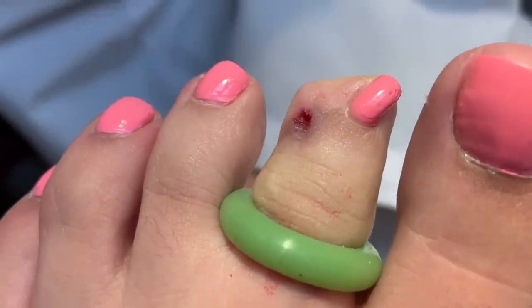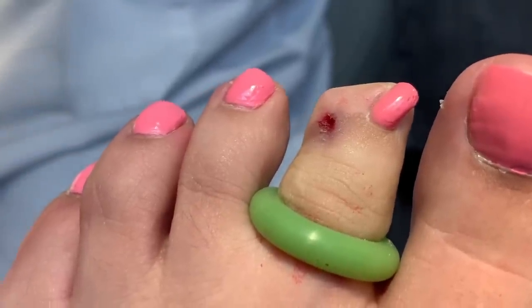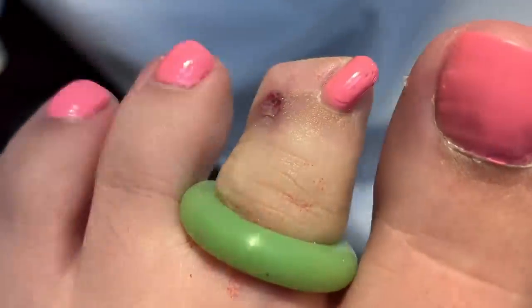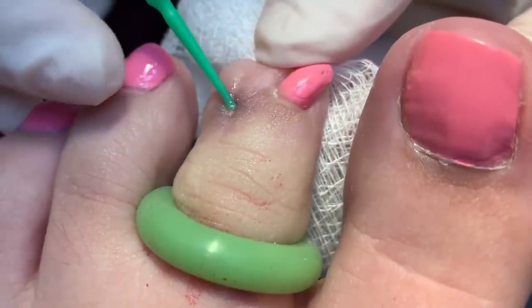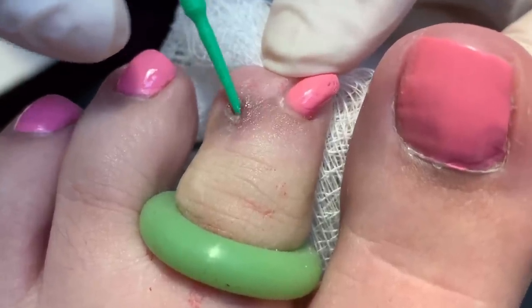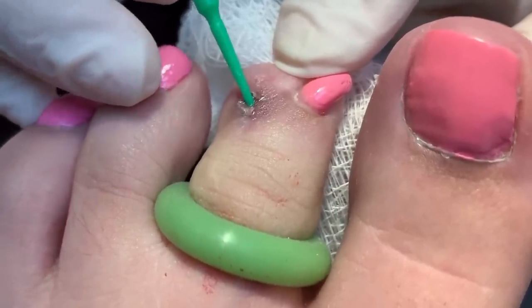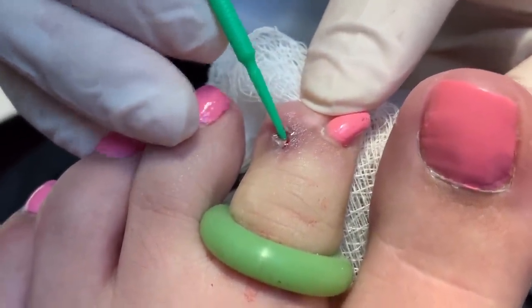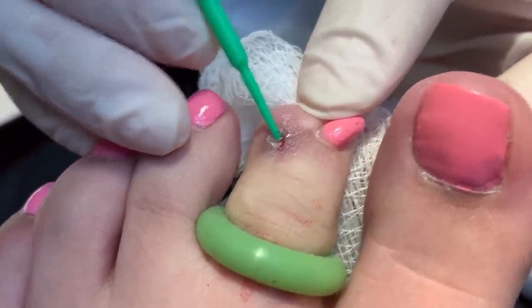So we're going to use some phenol — I'm using the phenol to cauterize this area, doing that for about 30 seconds to kill the root. This doesn't happen too often, but once in a while I see some of the nail kind of grow back, because we're purely going by location where we cut out the root. It's hard to tell between normal skin and the matrix cell, so we just go by location, and sometimes some of the matrix can be left over and then cause this nail to grow back.